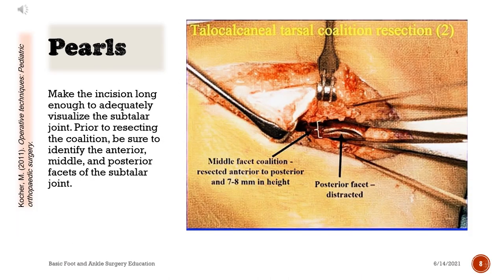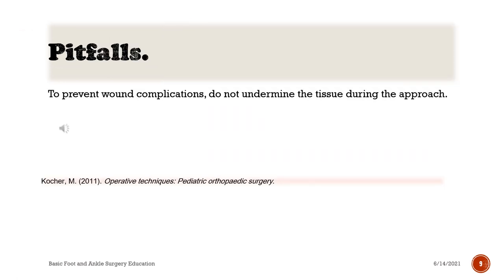Pearls: make the incision long enough to adequately visualize the subtalar joint. Prior to resecting the coalition, be sure to identify the anterior, middle, and posterior facets of the subtalar joint. Pitfalls: to prevent wound complications, do not undermine the tissue during the approach.